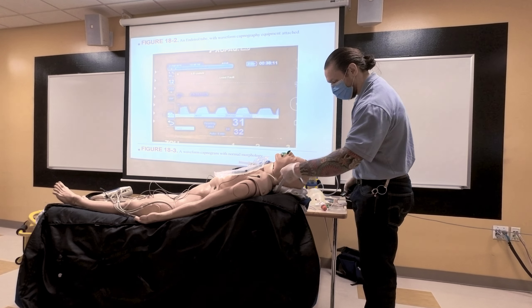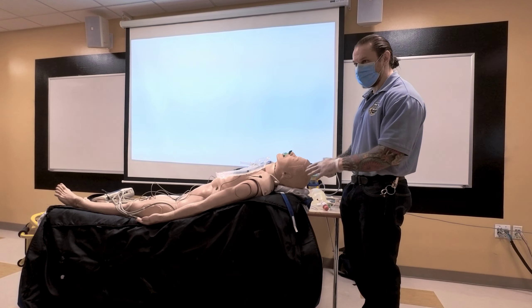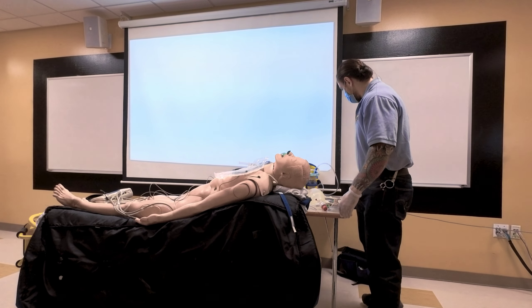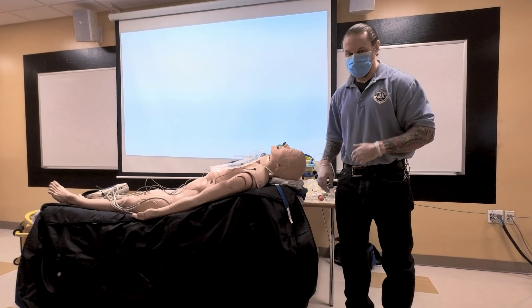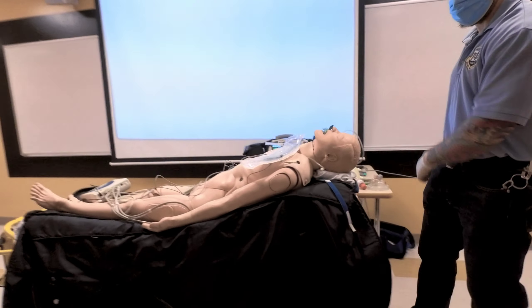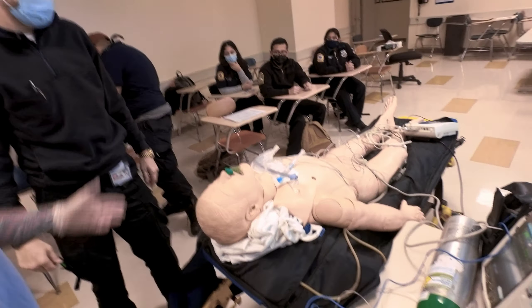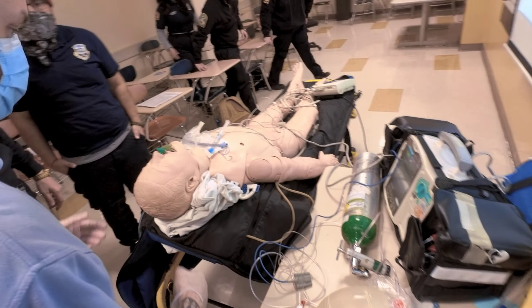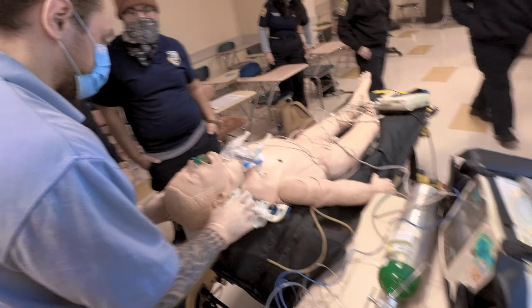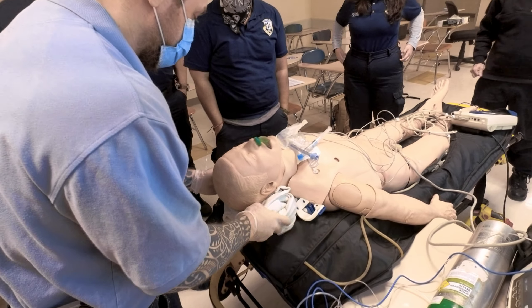This is the optimal view — white vocal cords, Cormack-Lehane grade 1, the best grade you want to get. When I see this I put my tube in. How far down? I want the cuff to go just past the vocal cords. Then I confirm placement with end-tidal CO2. I confirm placement before I secure it, before I put anything else on it.